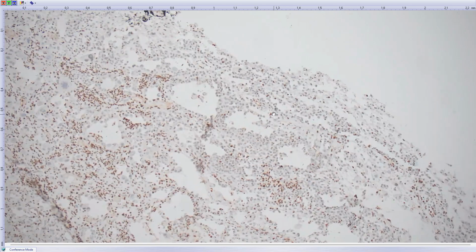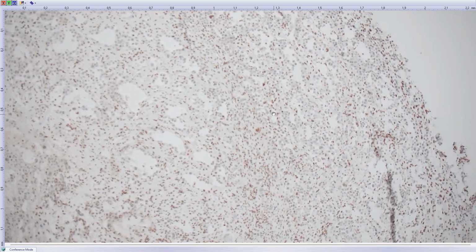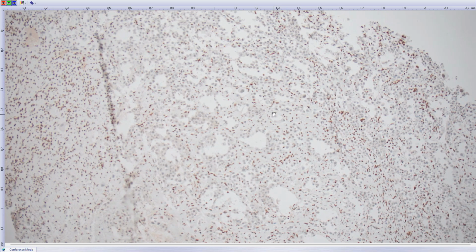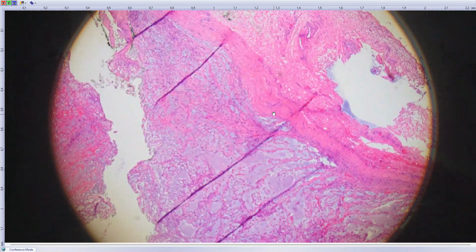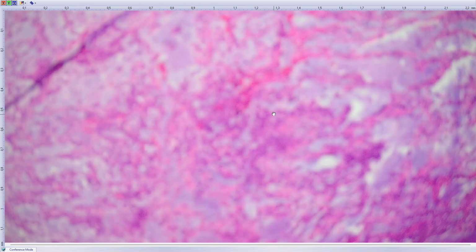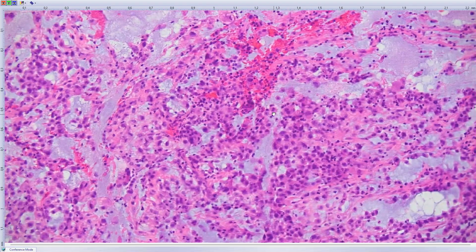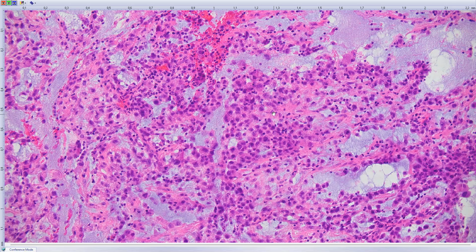So this is most likely a SMARCA4-deficient sarcomatoid undifferentiated tumor, and most likely the origin is somewhere in the lungs or thoracic cavity. The clinical course and the age of the patient is unfortunately perfect for this disease. So a relatively young patient, widespread metastatic aggressive disease, and also the morphology is very good. These rhabdoid epithelioid cells with abundant cytoplasm and high-grade features.